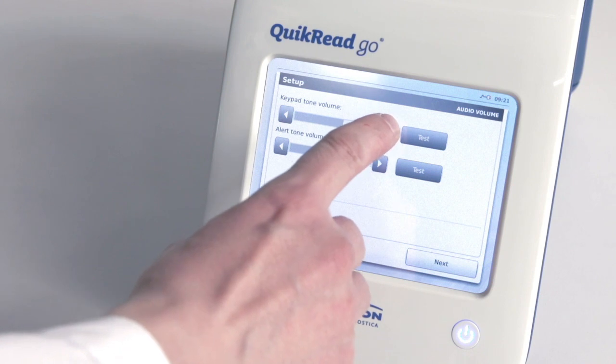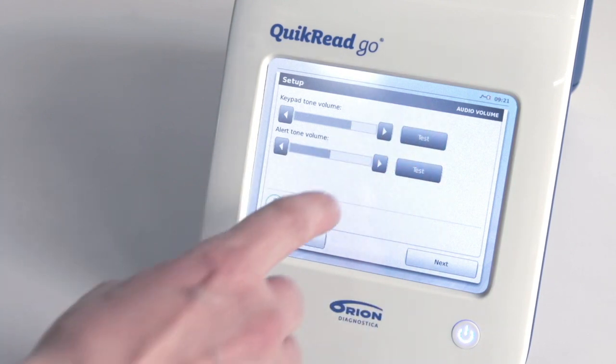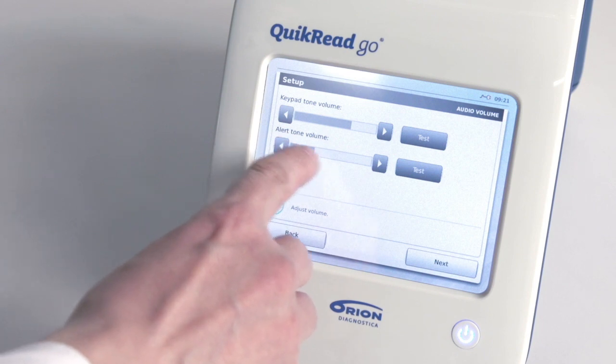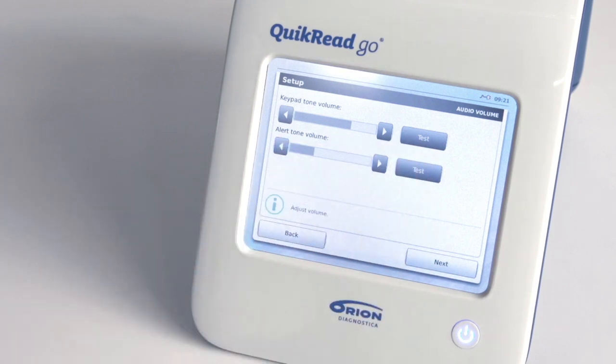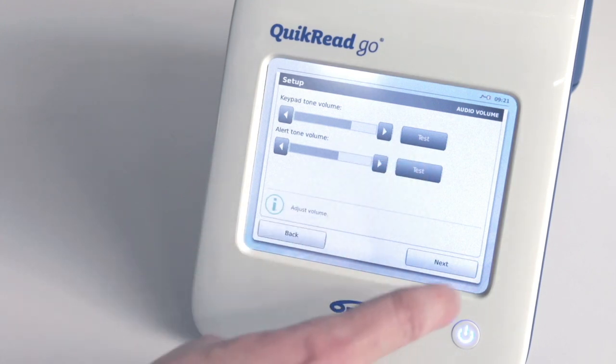The next step is to adjust audio volumes. Adjust the keypad tone volume with the arrow buttons. You can check the sound volume by choosing Test and listening to the sound. Do the same with the alert tone volume and then choose Next.